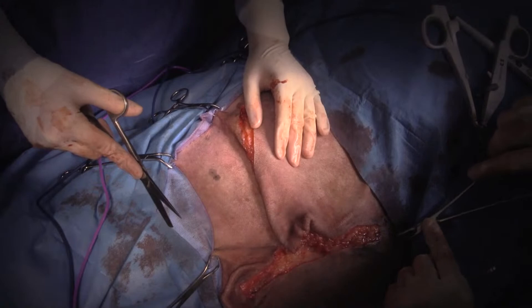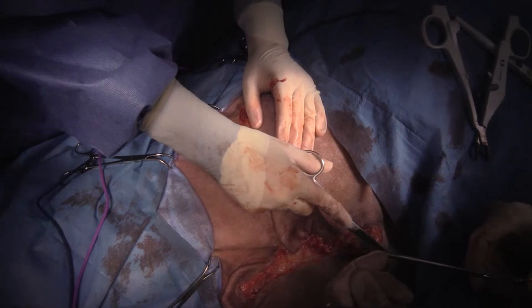All right — so that's going to come together really nicely. I will trim out some of that skin.